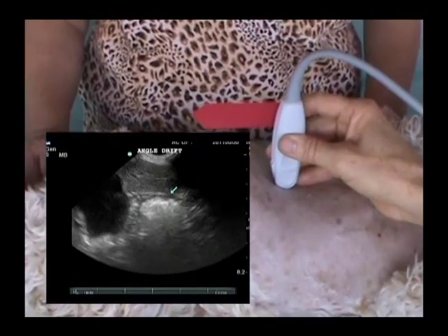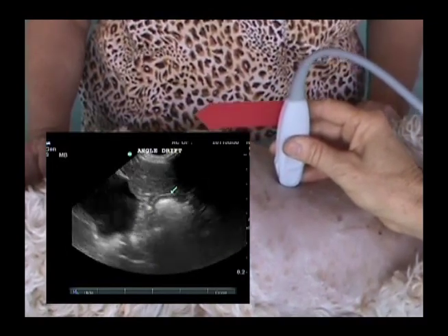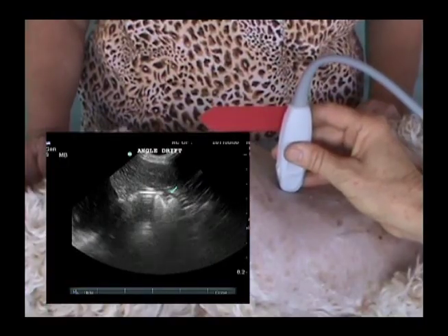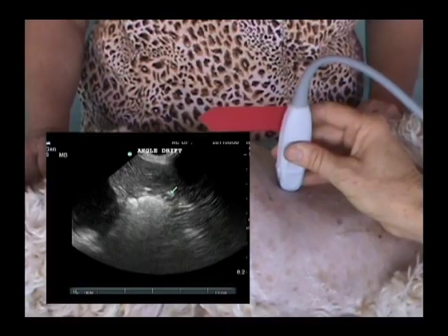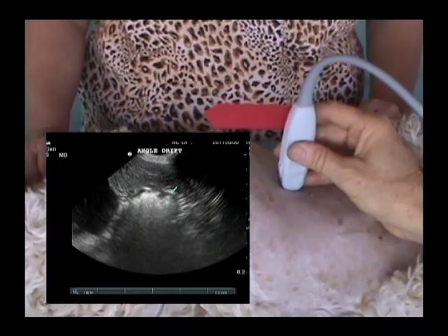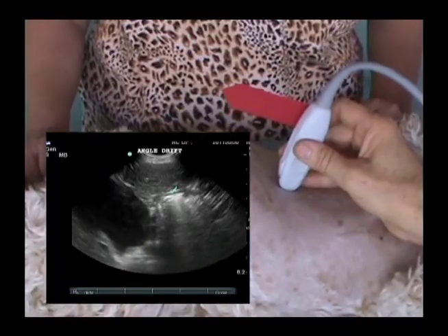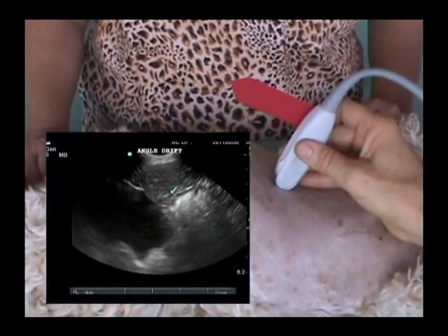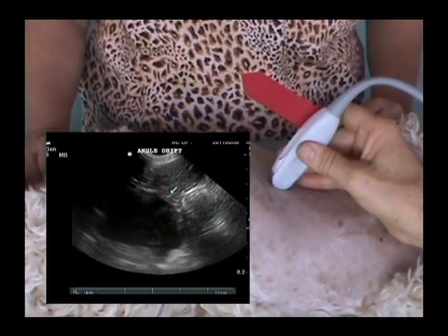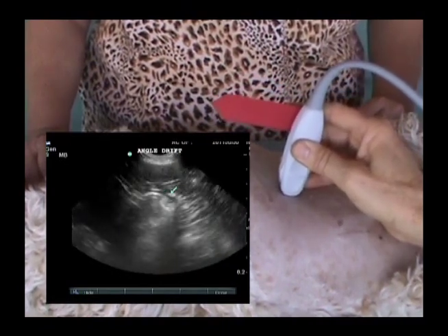I would like the stomach to remain at the green arrow on the ultrasound screen. For much of the ultrasound examination, the transducer hand is held in an unnatural position with the wrist extended. Once the organ of interest is located and centered on the ultrasound screen, most people relax. The wrist begins to relax to a more natural position. The angle of the transducer changes and the image begins to drift. Watch how far I must angle the transducer to return to the original view of the stomach.